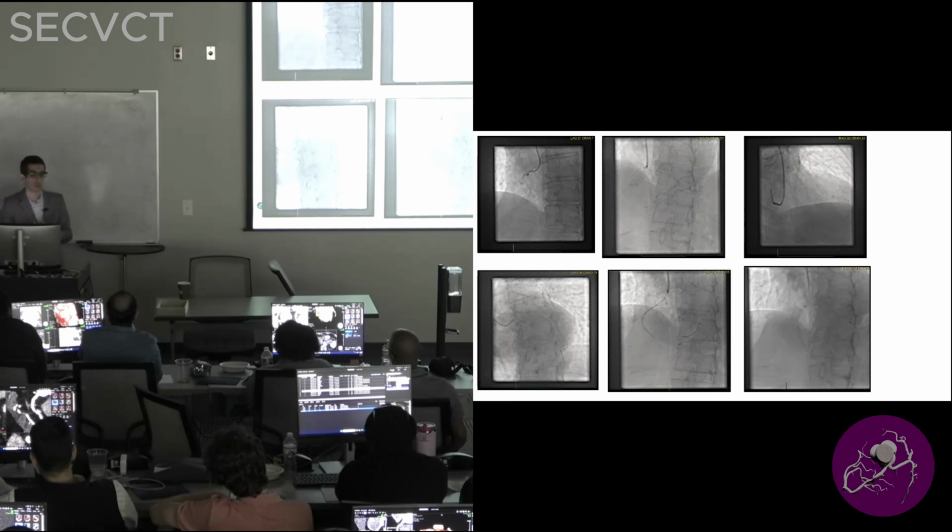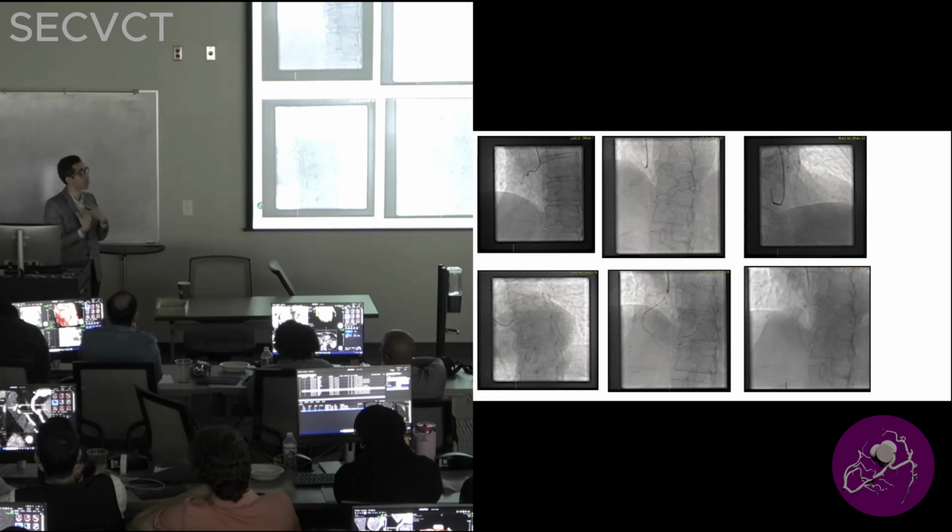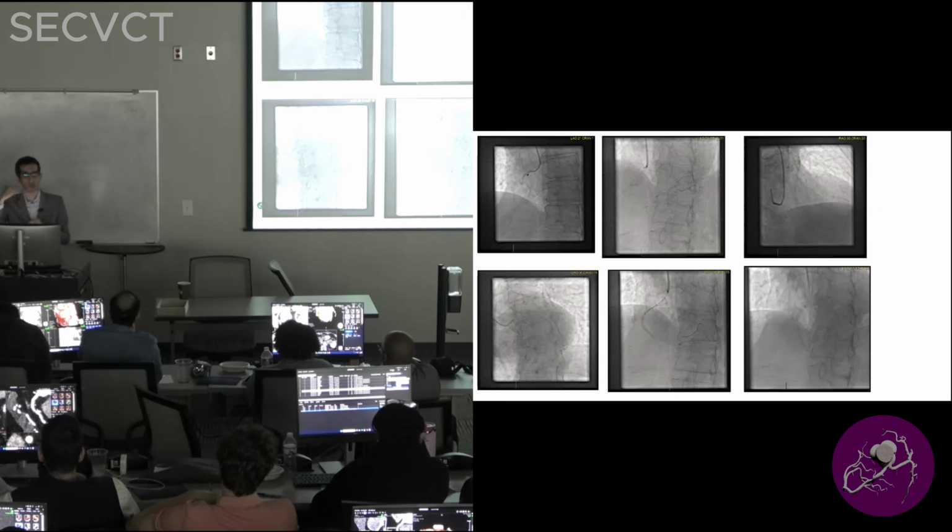The third part is the nitroglycerin. I cannot emphasize enough, nitroglycerin is so important for the disease assessment. The CT-FFR relies on, I believe, the 0.8. I know people sometimes say 0.4 can be used, but I've seen it: the gradual decrease becomes more of an issue when you have the 0.4. So I'm a big fan of the 0.8, and that's one of the reasons, the CT-FFR.